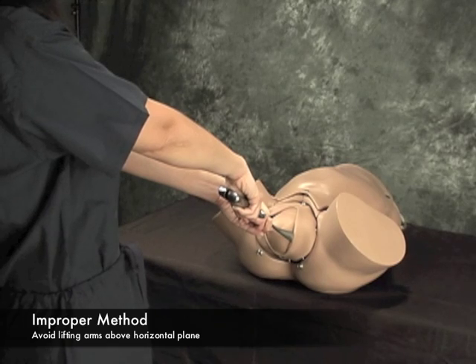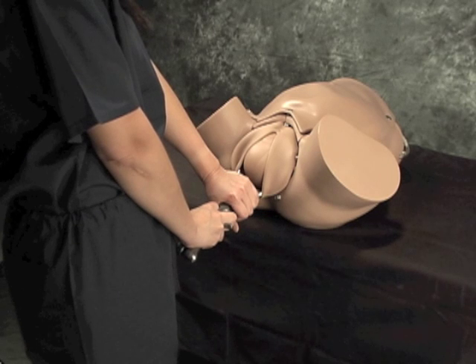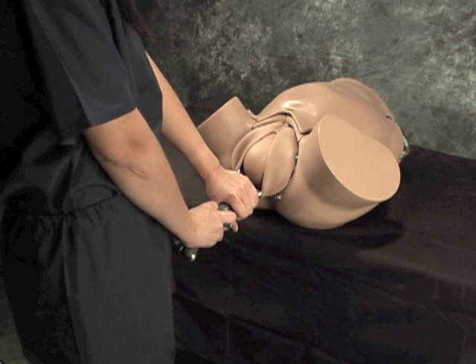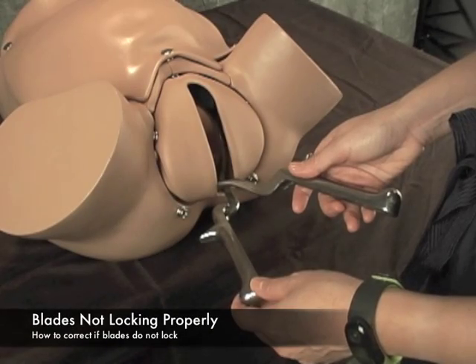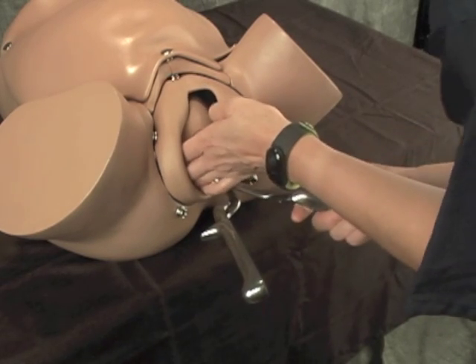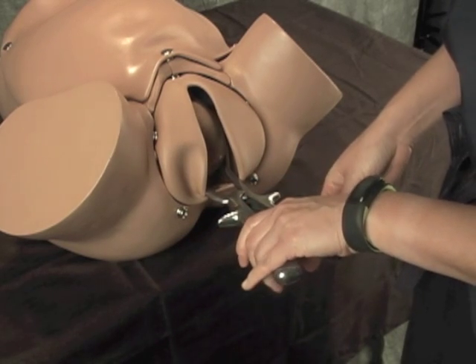Avoid extending your arms. Instead, keep an erect posture with both feet planted well on the ground, keeping elbows close to the sides and using only arm and shoulder muscles. Apply steady pull in conjunction with uterine contraction and maternal pushing. If the blades don't lock properly or diverge widely, readjust application by lowering the handle while slightly elevating the heel of the anterior blade. If the handles fail to lock, remove the forceps and repeat application.